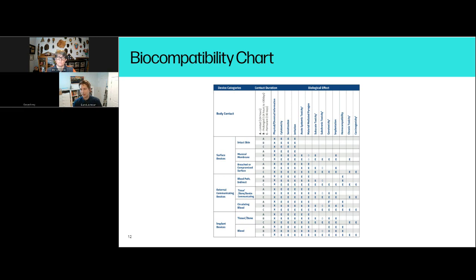So you would need to have intimate knowledge of what chemicals are coming in contact with the product at each of the vendors. And that's where sometimes it becomes a little bit difficult. I'll have people who are trying to use a 510K product that doesn't belong to them, which means that they may not have intimate knowledge of what's being done. If you have intimate knowledge, you can have a separate vendor. You just have to analyze the chemicals that are coming in contact and evaluate whether or not additional testing is needed. Gotcha. So if you have gaps in information like that, it's likely you'll just have to go through the testing regardless? Yes, unfortunately.